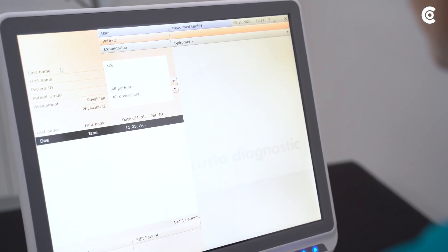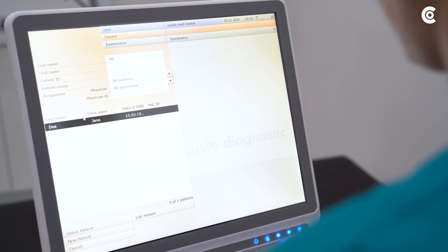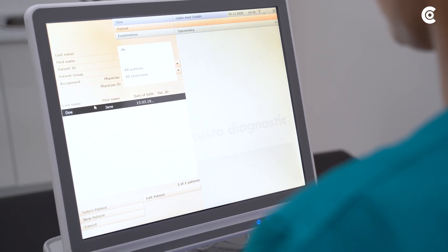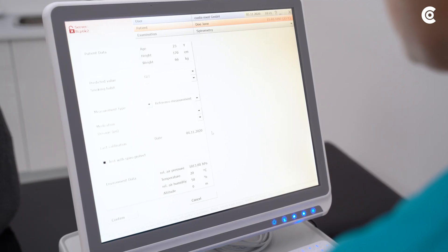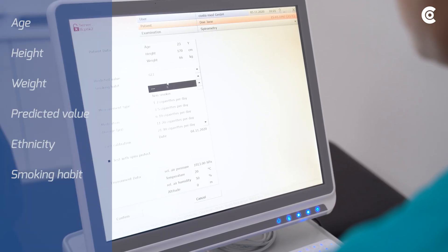Before starting the measurement, enter the ambient conditions and the patient data in the software. Either use existing data or type in the required information now. Verify that all patient data are correct.